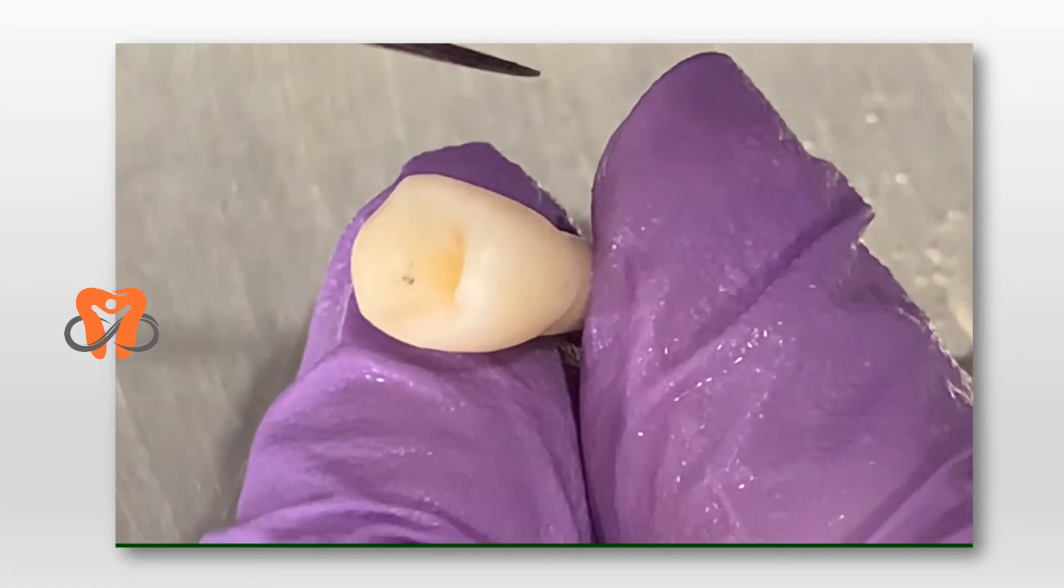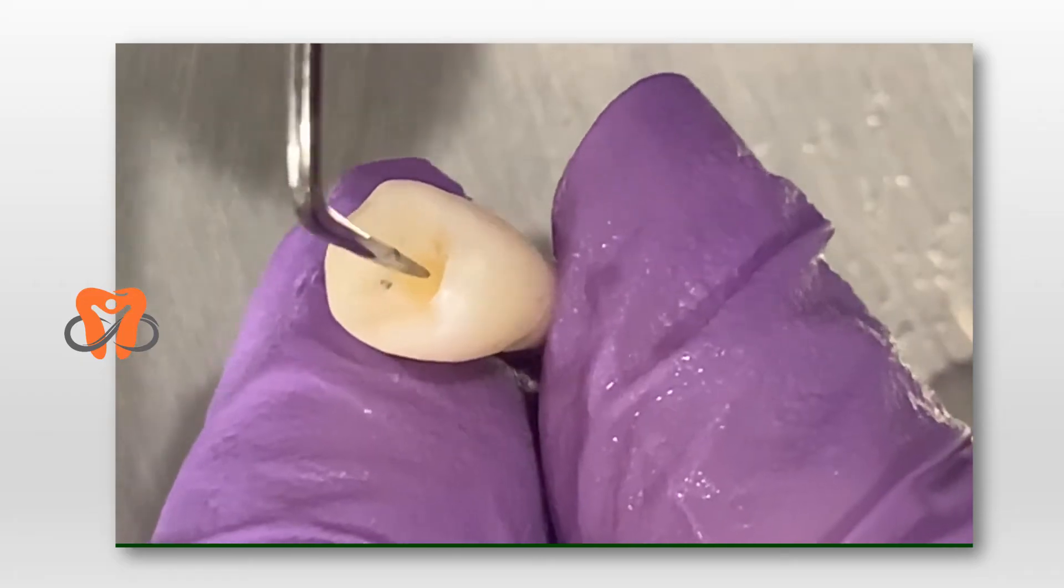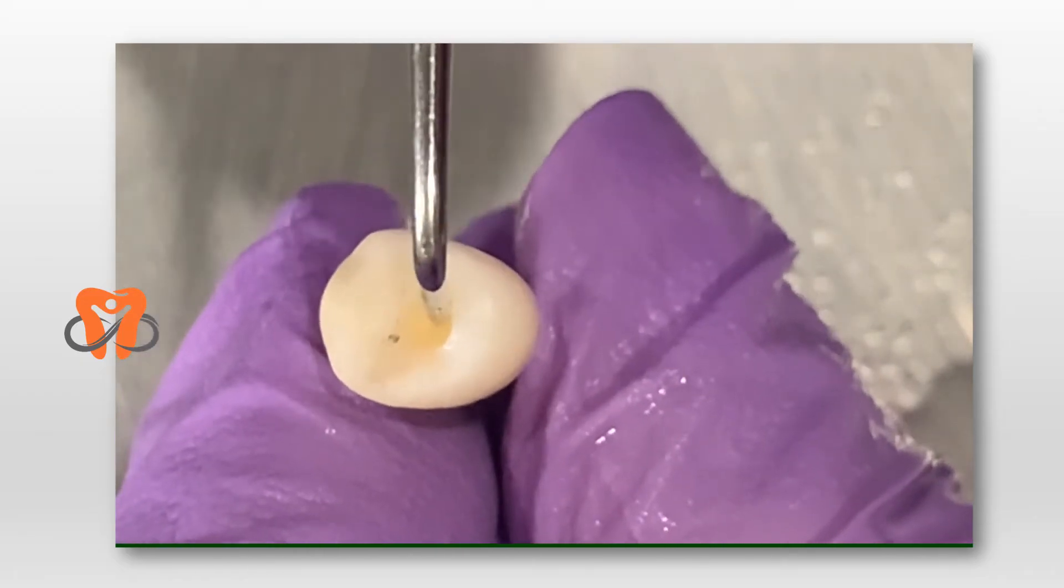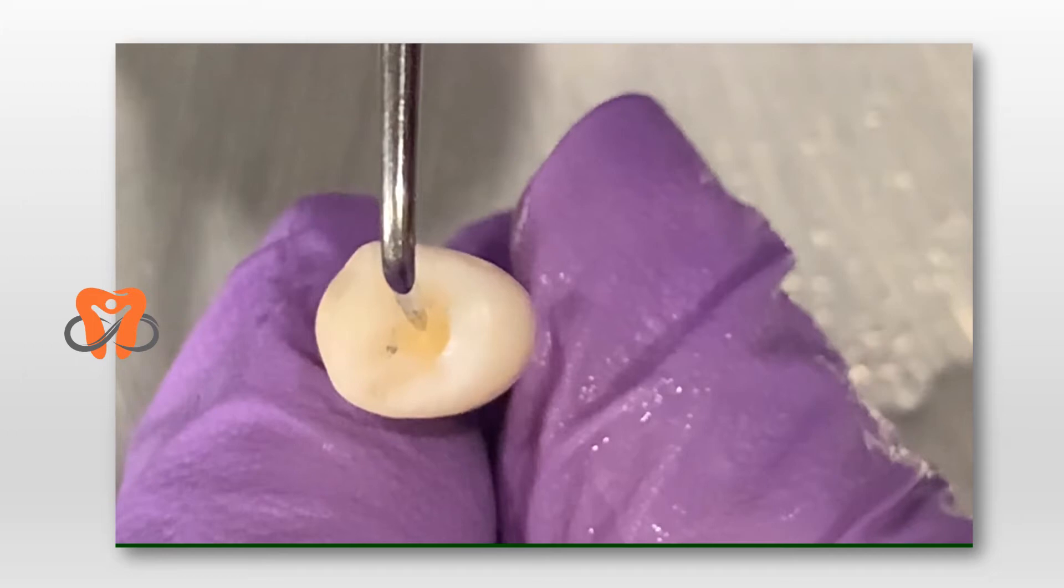I have cut through the enamel and I've made a notch. Now keeping the burr in the same position, we'll cut deeper into the dentine to reach the pulp chamber.